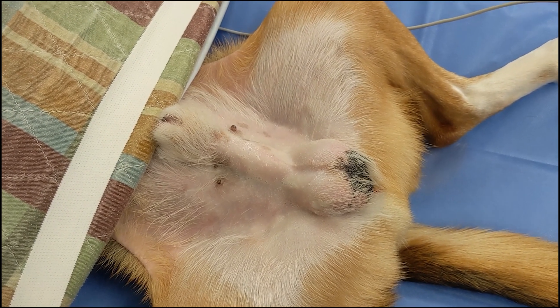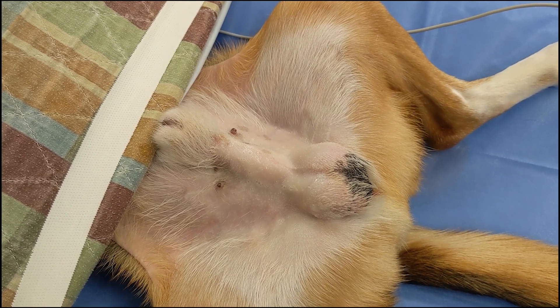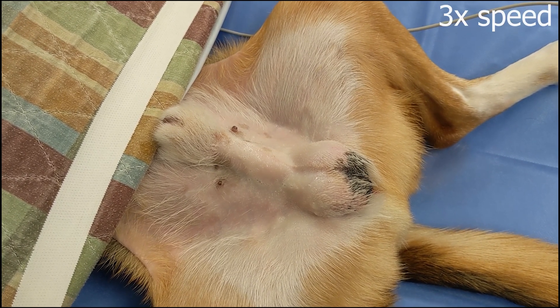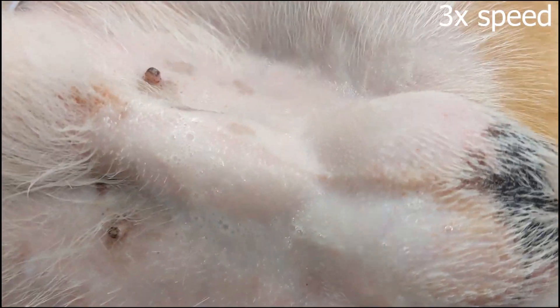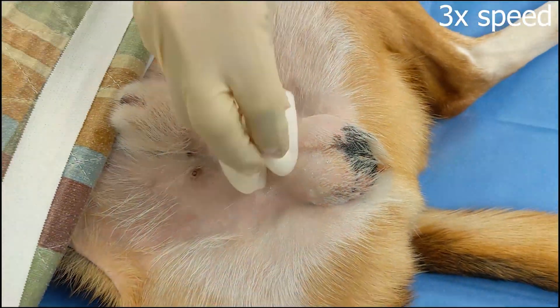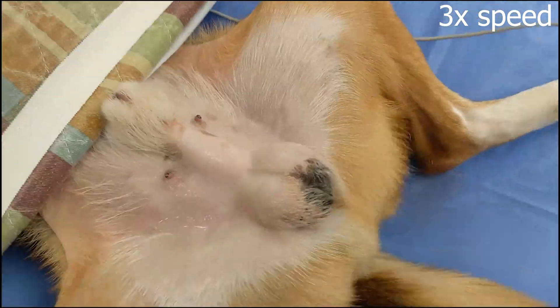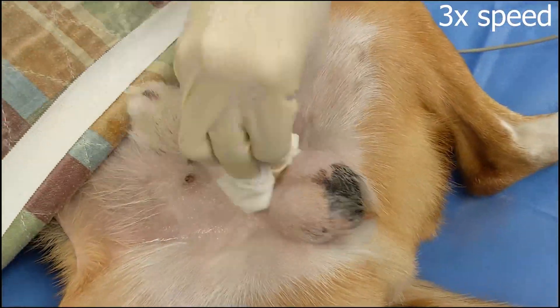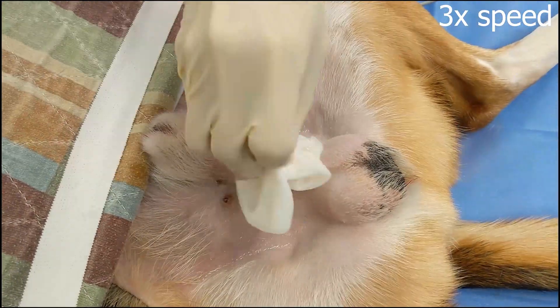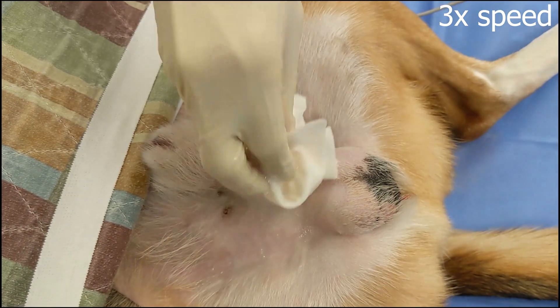We typically let the chlorhexidine sit on the skin for about 30 seconds in between rounds of chlorhexidine and alcohol scrubs. Next is a round with alcohol gauze to clear the skin of the chlorhexidine, then we repeat another chlorhexidine round. Notice how all motions start at the surgical site and sweep outwards, and never return back towards the surgical site.